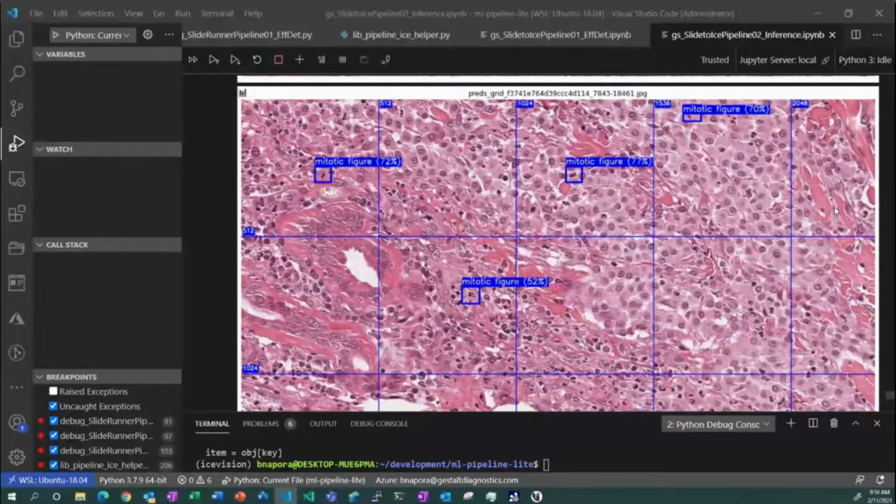The things that I'm working on is how we visualize this within the digital pathology platform that our customers utilize. And so just imposed a grid that highlights the actual patch size that we're doing inference on for this region of interest.